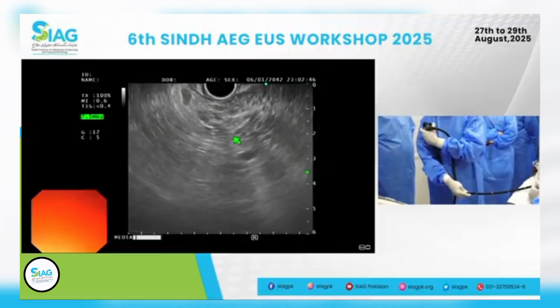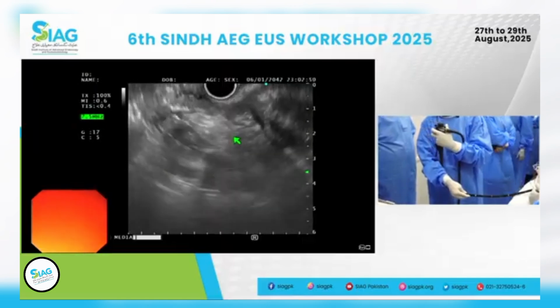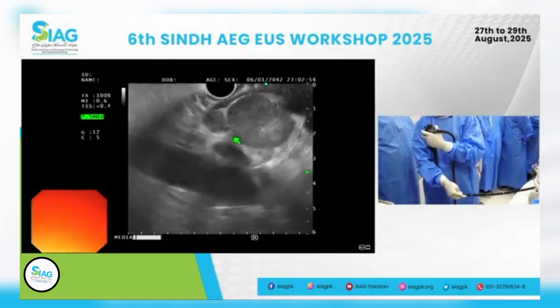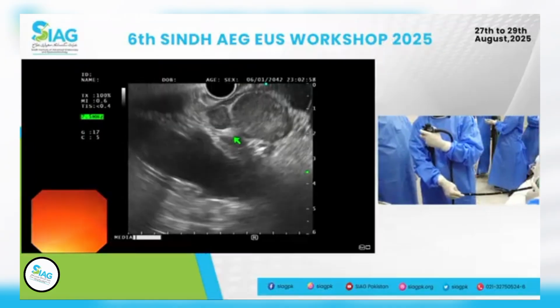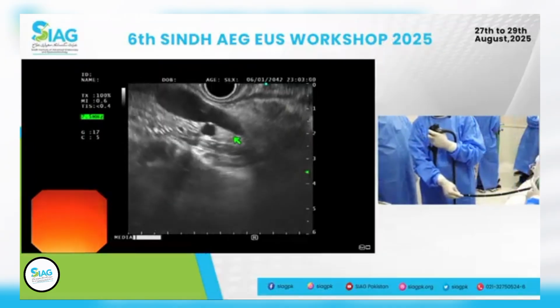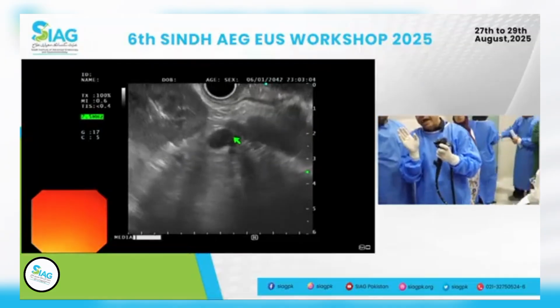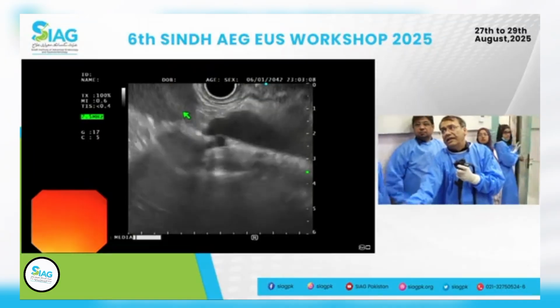Now coming back, right here, uncinate process, going further to the left, head of the pancreas comes up there. There's a small lymph node as well. Further to the left, aorta at the bottom. Further to the left, IVC. Further to the left, right kidney. Now I will do this one with one hand. Kidney.